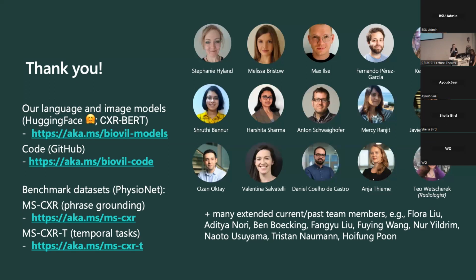Yeah, so I'm not sure about scanner differences, but because this is an ICU data set, there are a lot of AP or PA images, so basically which direction the patient was facing when the picture was taken, or whether they were standing up, lying down or sitting. As the person asking the question noted, that can have quite an impact on the interpretation. For example, if a patient is lying on their back, the fluid in their lungs looks different to if they're standing up, gravity and so on. So those can have an impact.